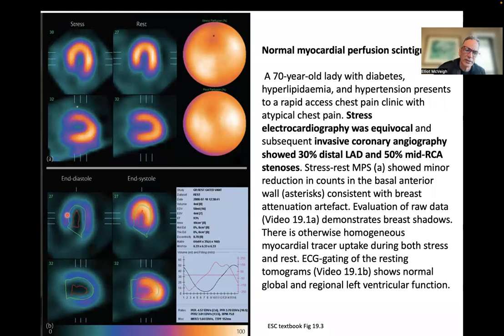So I have 5 images. And then one of those images will be when the heart is most full of blood at end diastole, and then this will be end systole. And you can see the concentration of counts as the mechanics of the situation bring all the tissue together. So you get a much brighter picture at end systole than you do at end diastole.